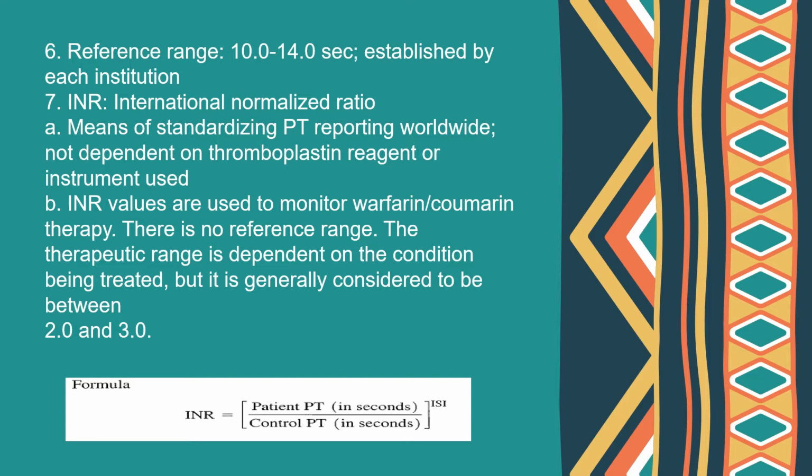INR means International Normalized Ratio. So this is a means of standardizing the report for PT worldwide. This does not depend on thromboplastin reagent or the instrument used, but there is a formula that we can use for this, and it's shown below.